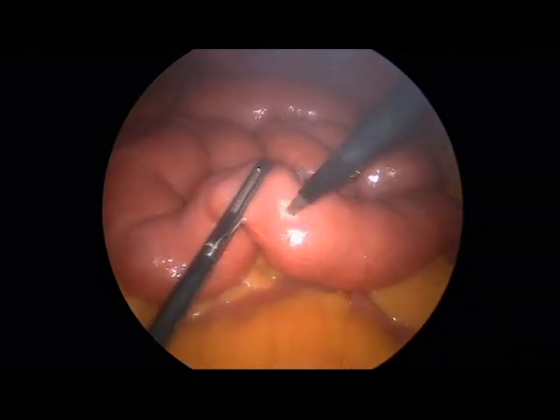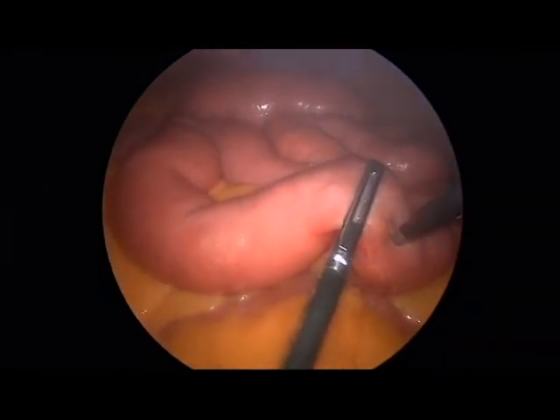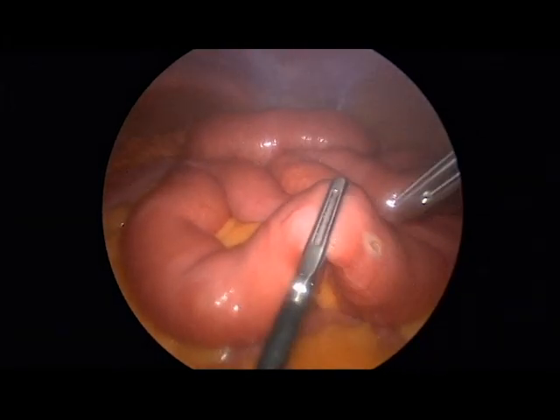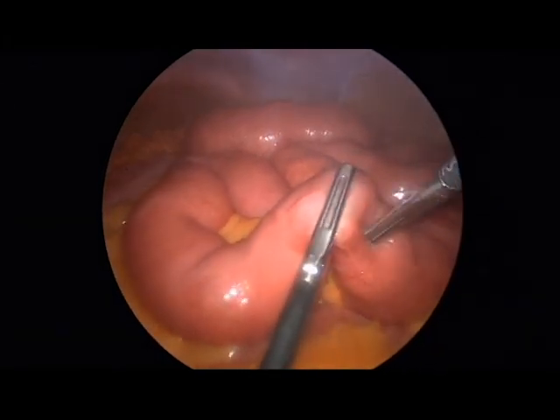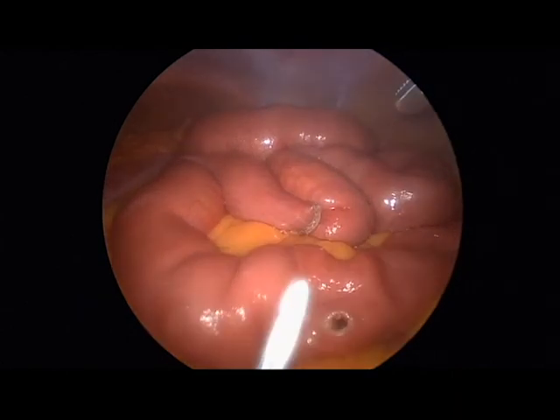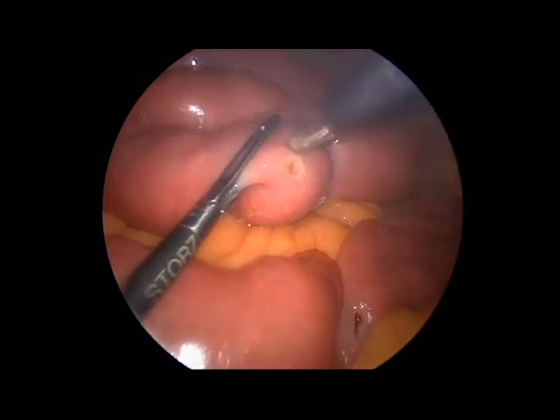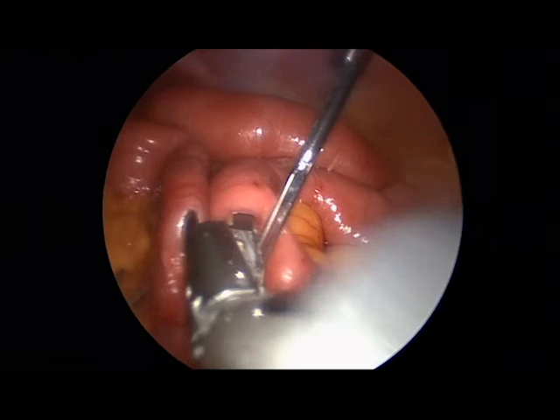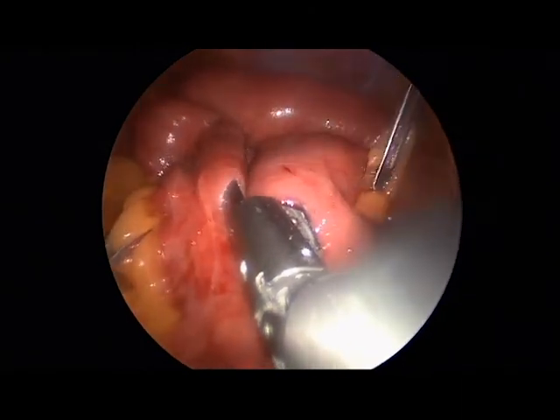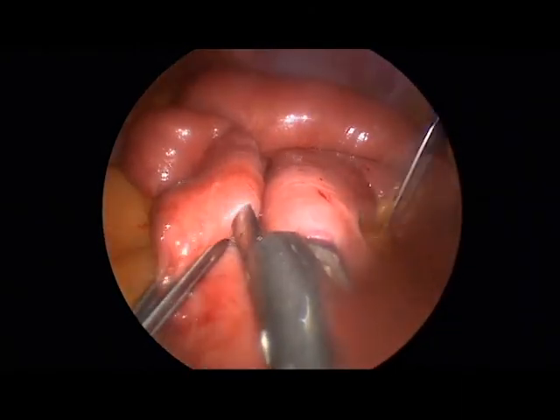Scissors with electrocautery are then used to create enterotomies on both sides for subsequent creation of the jejunojejunostomy. Here the gap is widened with a bowel grasper. A corresponding enterotomy is similarly made and another firing of a linear cutting stapler is used to create the jejunojejunostomy.